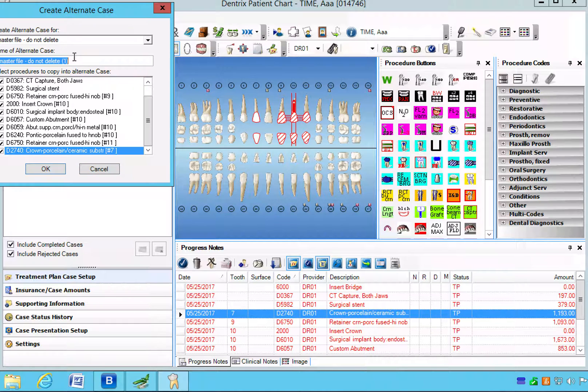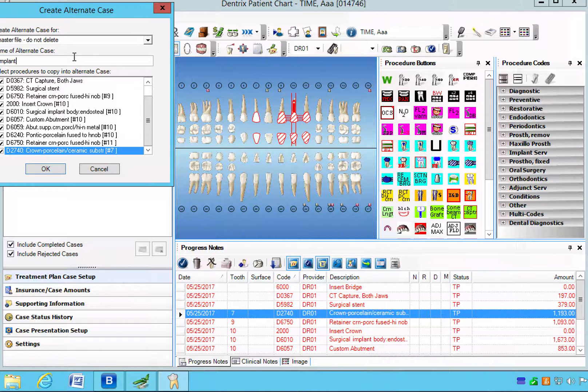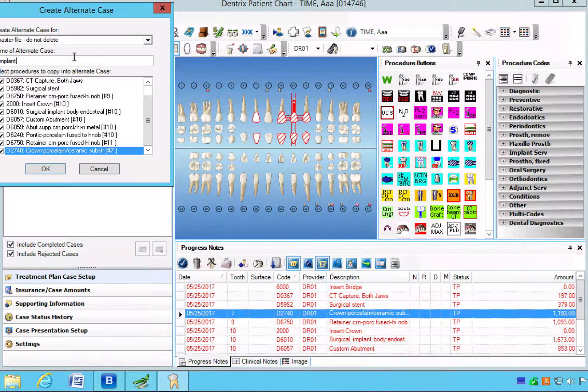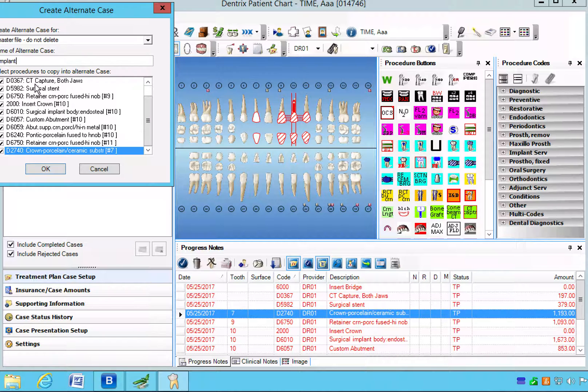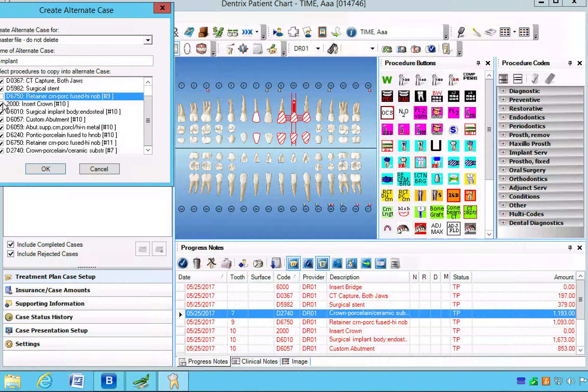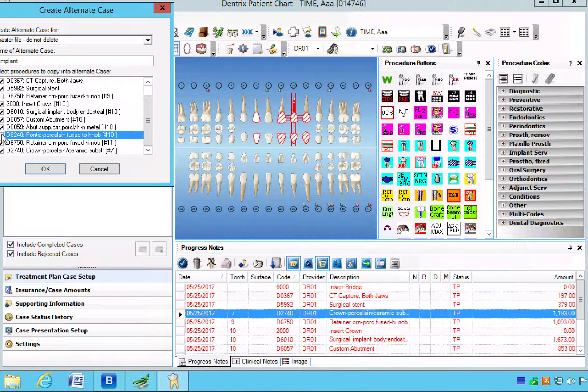Now first we have to name one of them. We'll call it the implant option or alternate case. And what we need to do now is unclick all the items we do not want to show up because they're not going to copy, so we don't want anything associated with the bridge to show up. So we're going to delete anything that has to do with that bridge.